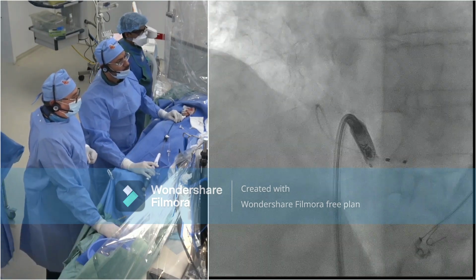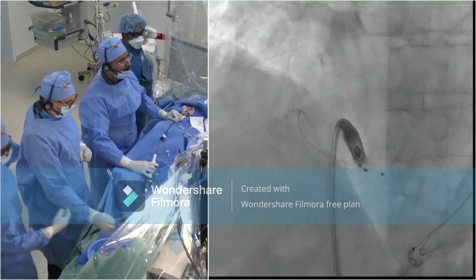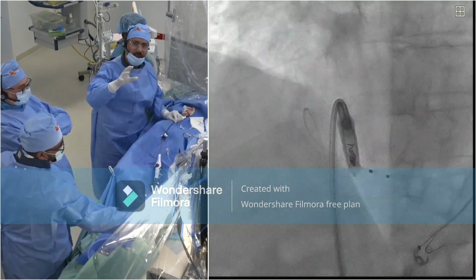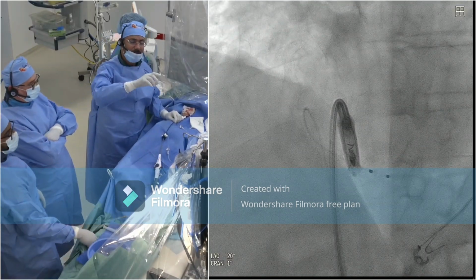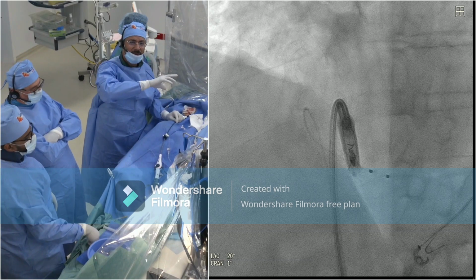This is going to be very tough with this patient. I agree. Yeah, manipulation is very difficult here because the heart is rotated, as I mentioned. Yes. And something which is very important, guys: with AVEIR, you cannot place it high on the septum because the device is too long. It will create problems with the tricuspid valve.